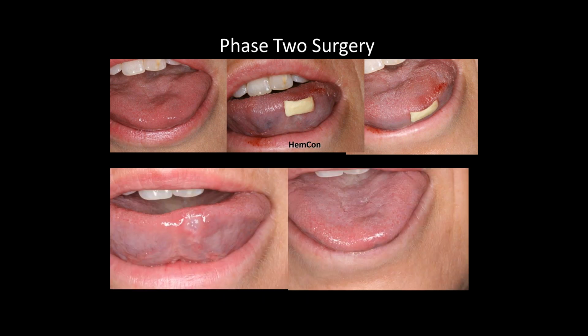Hey Jay, there's another question here. Have you ever removed pigmentation on the tongue? I've done it on the gums. I have not removed it off of the tongue.